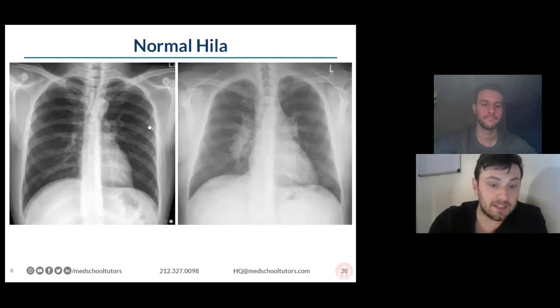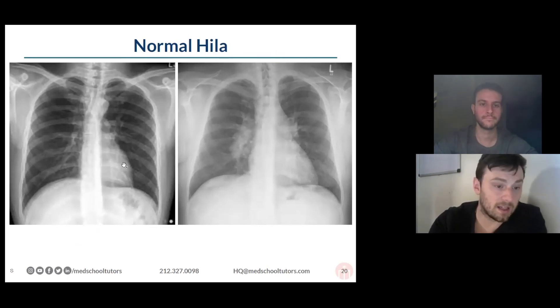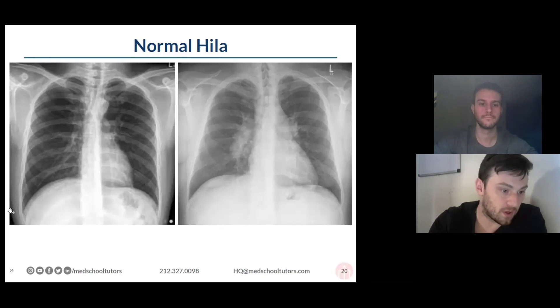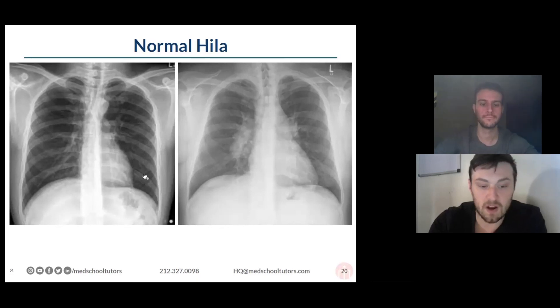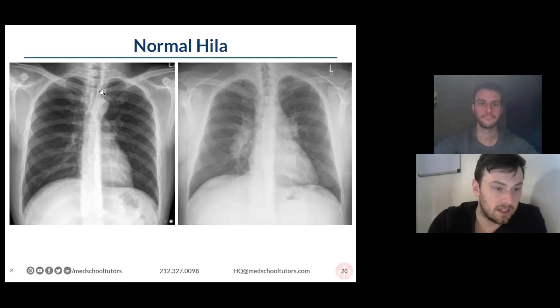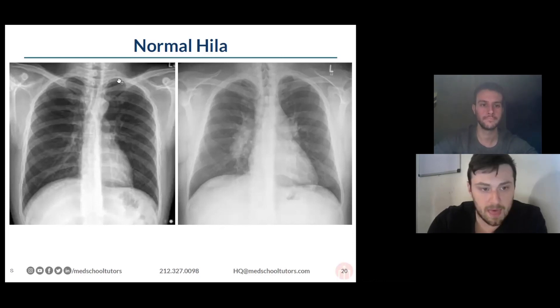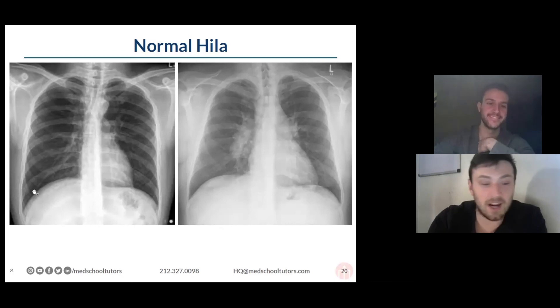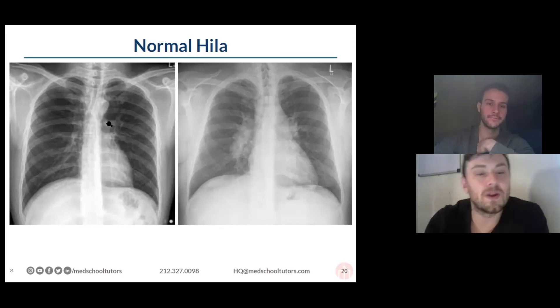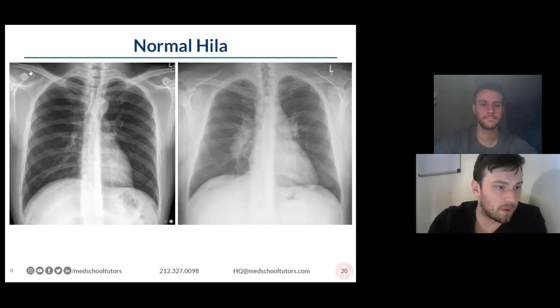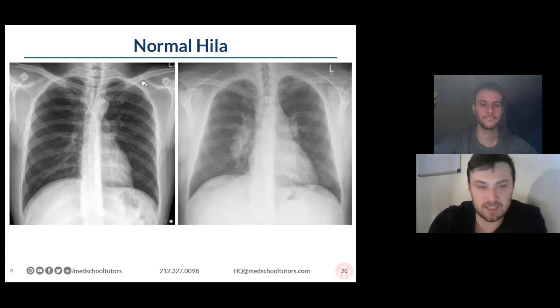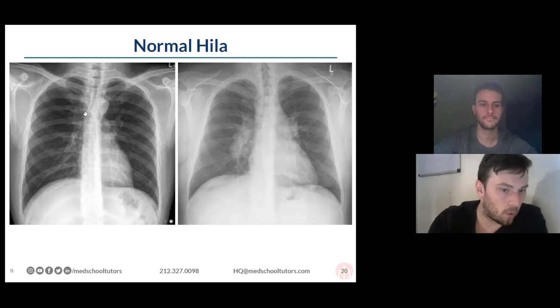This is a nice comparison between the two. This is your normal chest X-ray again — doing your ABCDE. A: you've got a nice airway here. B for breath: you have your nice sharp costophrenic angles, no fluid. C is cardiac: you have your nice cardiac silhouette. D and E: you check under the diaphragm for free air — free air usually indicates a perforated viscus. E is everything else, which usually stands for your bones.